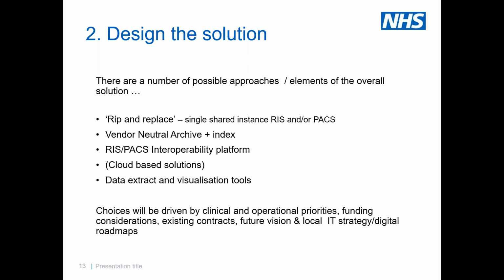Do you want data extract and visualization tools? You almost certainly do, but they're fairly generic, or they can be very specific. So again, the PACS suppliers are starting to develop these tools and have these available. Equally, there are local groups who are taking a slightly different approach and more of a tailored local hand-built approach. Extracting DICOM data is relatively simple. It's well standardized, so it's relatively simple to get hold of.